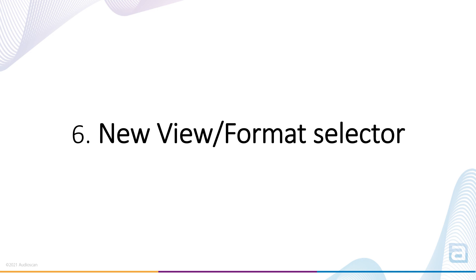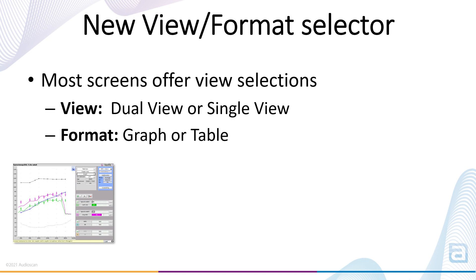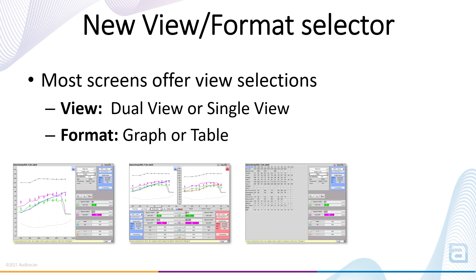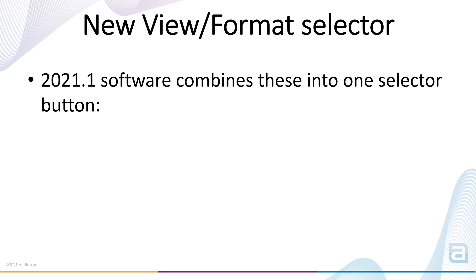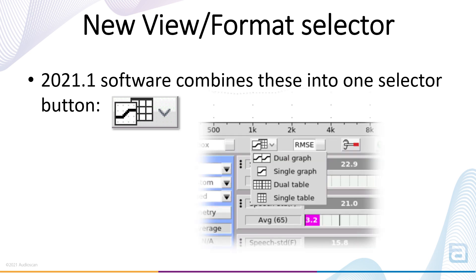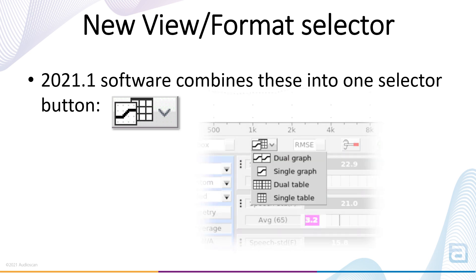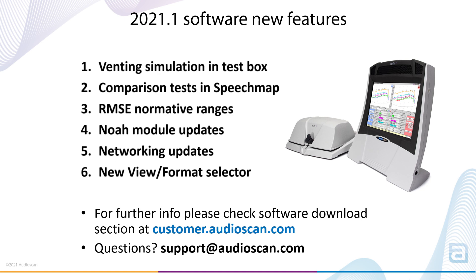New view format selector. Most test screens in the Verifit 2 offer the choice between single and dual view and between graph and table format. In previous software these selections were made in two separate text-based selectors. For convenience, these have all been combined into one easy quick menu. Thanks for taking the time to look at these new features. Full instructions are available in the updated user guide included with your download. Please visit our website for software downloads and further information, and contact us if you have questions.